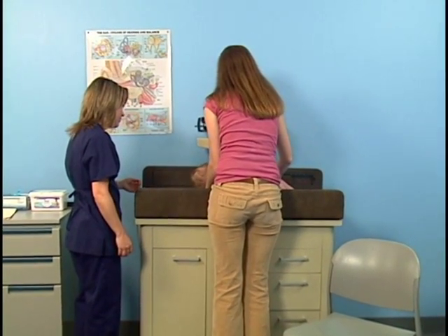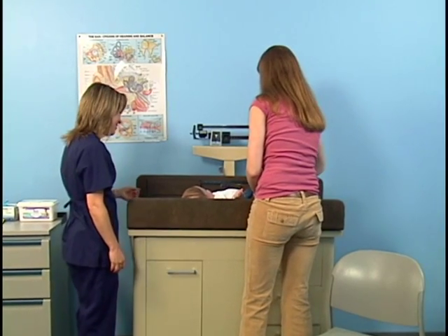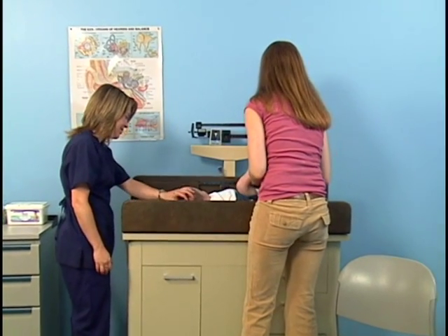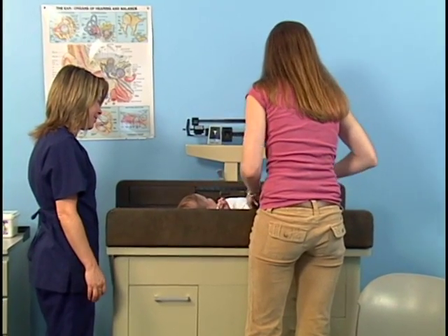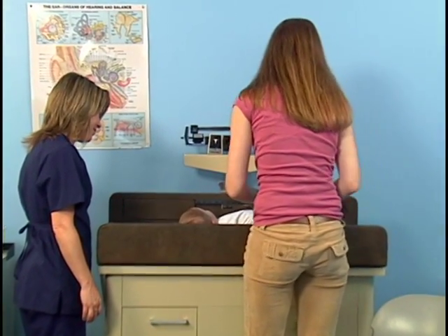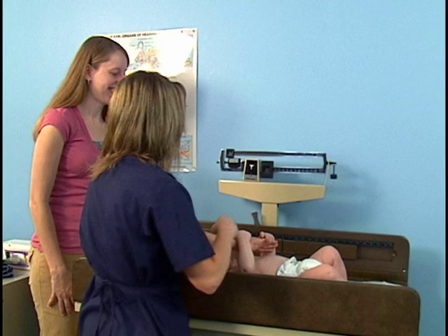Do not weigh an infant with a wet diaper, as it could increase the weight considerably. A dry diaper has a minimal effect on the weight of a healthy infant. Growth charts for infants and young children base their percentiles on the weight of the child without clothing. Gently place the infant on his back on the table of the scale. Place one hand slightly above the infant as a safety precaution.